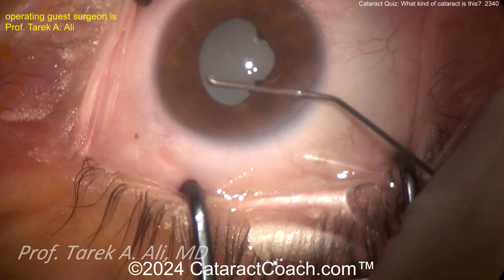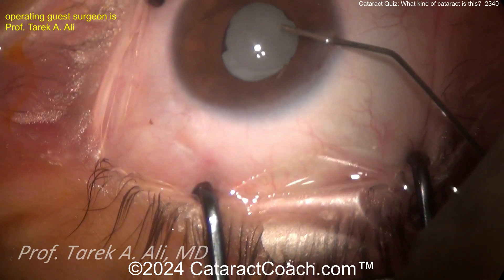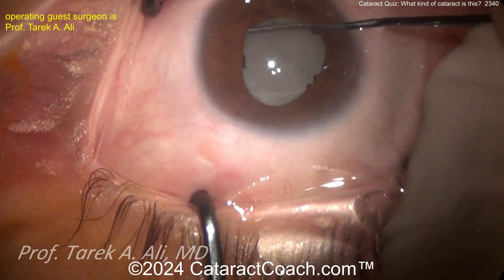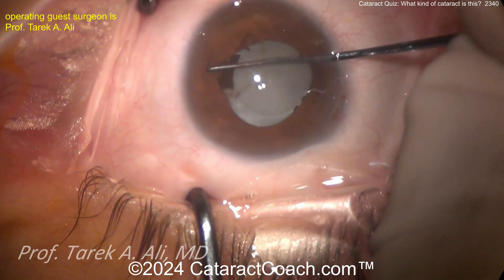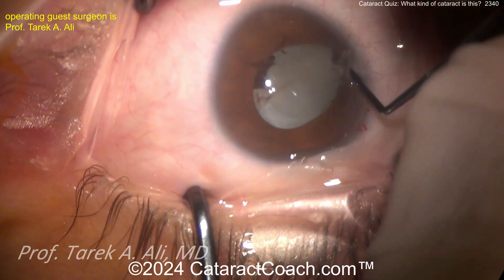Why did this happen? There are a lot of different reasons. The most common opacified IOLs we see are the hydrophilic acrylics, and there have been a lot of cause-and-effect studies that have implicated those. Fortunately, it's a pretty rare event. Here you can see there's some synechiae that's being split and broken with the chopper.